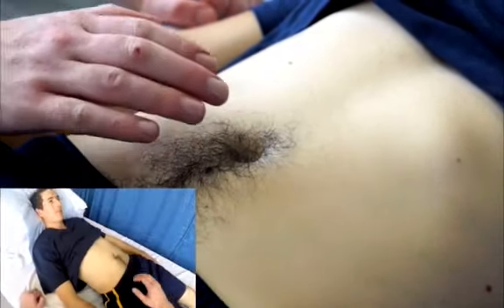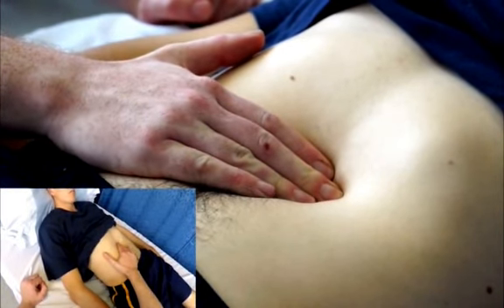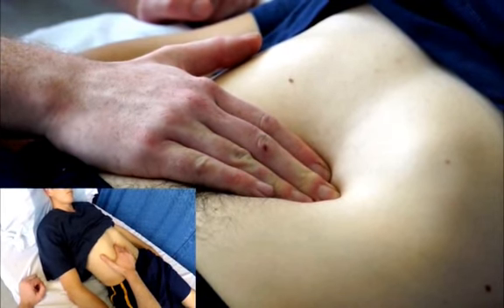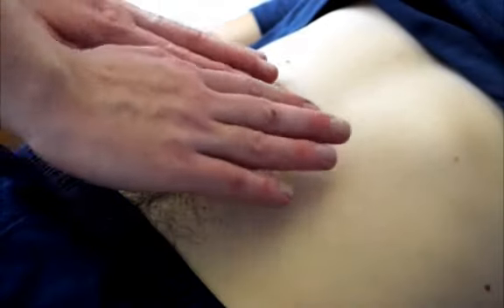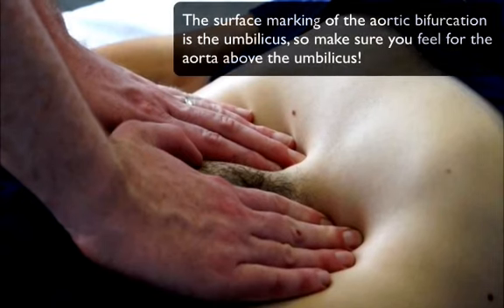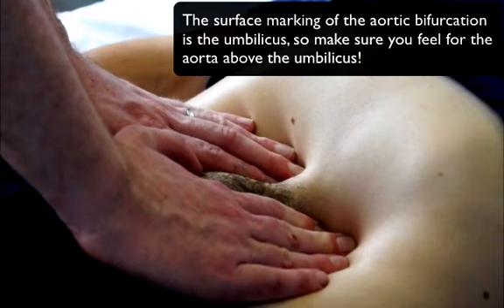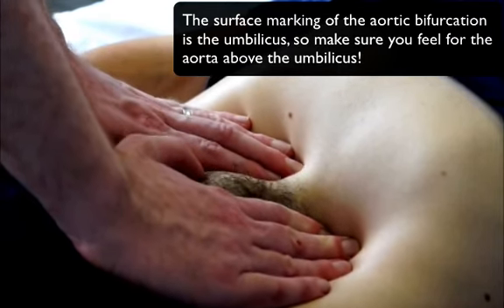In the abdominal vascular examination, what you're really feeling for is aneurysmal disease. The first thing to do is to lay a hand on where an abdominal aortic aneurysm would be. I can feel the aortic pulsation, but it's not aneurysmal. If you felt an aortic pulsation and you thought it was aneurysmal, you then put a hand either side of where you feel that pulsation. What you're really looking for is an expansile pulse. If you had a patient with an aneurysm, what you'd see is your hands moving apart.